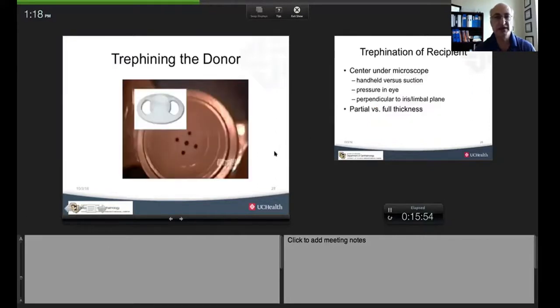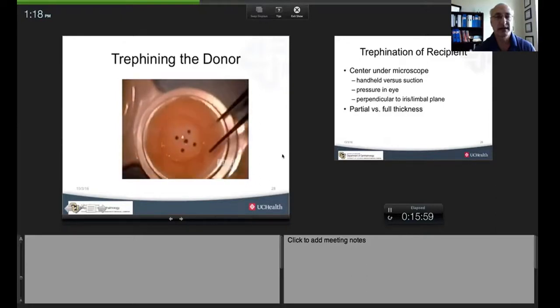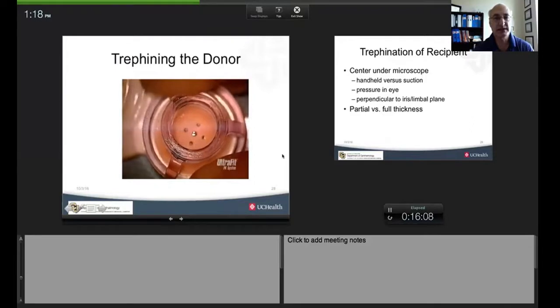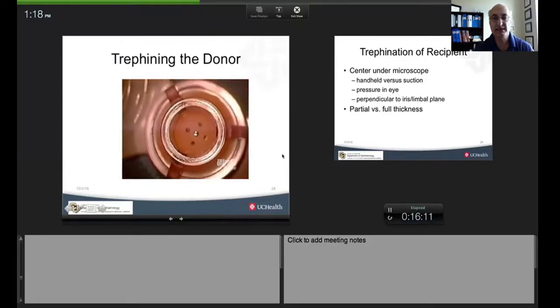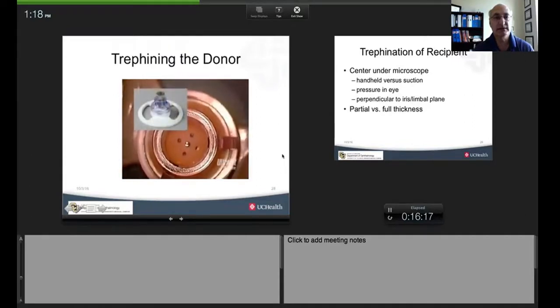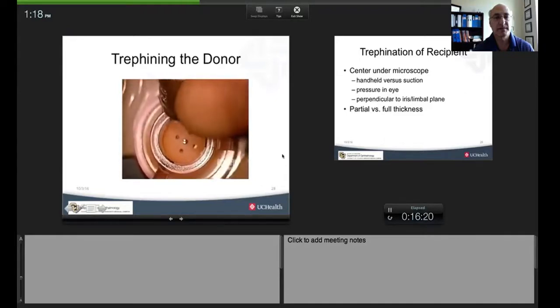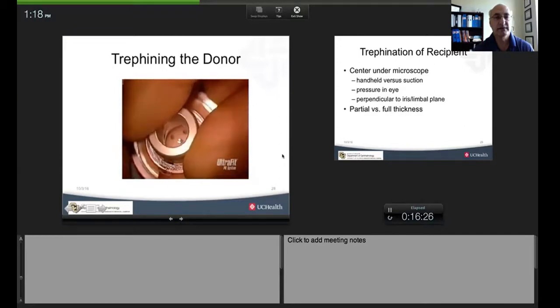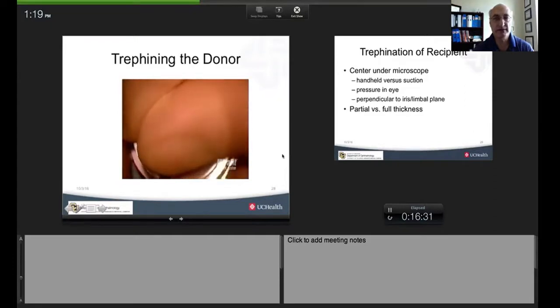So this just illustrates how to trephine the cornea. And one thing I actually like to do is to trephine under the surgical microscope, because I think you can see this a lot better. This is a guided punch. Again, this is the UltraFit system, but what I'm talking about here applies to any guided system. So you brace the cornea with your left and your right hand. And then you center the blade. Once you touch the endothelium, you can't come off. You press easy, and then you press very hard.